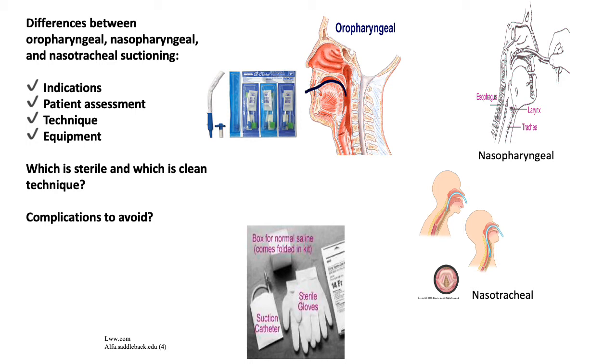Right before you do it, another good thing to have your patient do is to cough, and that will help bring up any secretions that the patient is able to, and you can suction those out. When you insert the suction catheter, which you would connect to the wall suction, you insert it without applying suction. Suction is only applied when you are removing the catheter. I will show you this process when we get to lab, and you only suction for 10 to 15 seconds. And then you allow the patient to rest. You put the oxygen back on them.